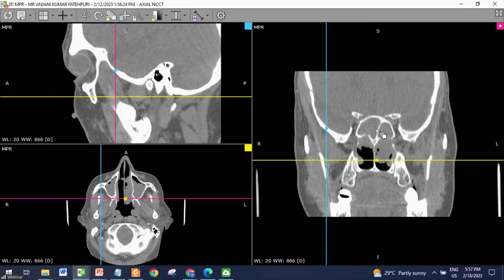So can we start now? Yes, sir. Sure, sir. This patient has massive eosinophilic disease, massive polyposis, and now you must be tired by now this morning. So this is going to be the last case before the evening party. We are not tired, sir, when our teacher is not tired. I know, must be tired.